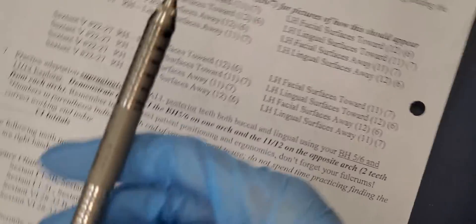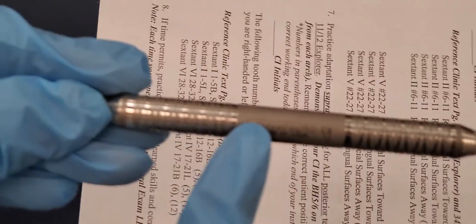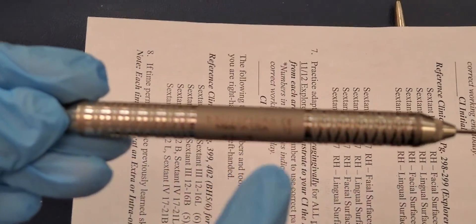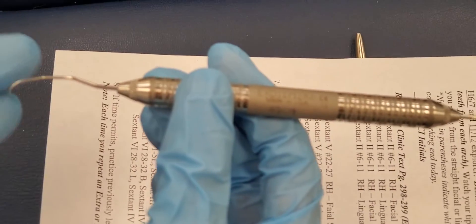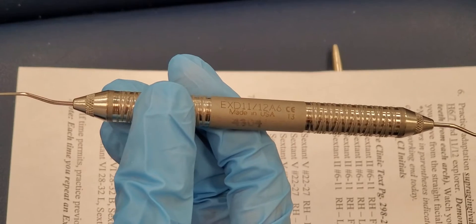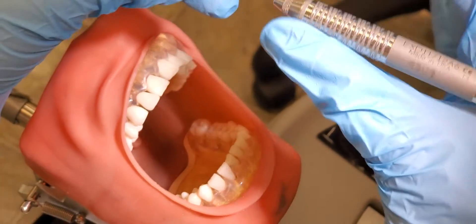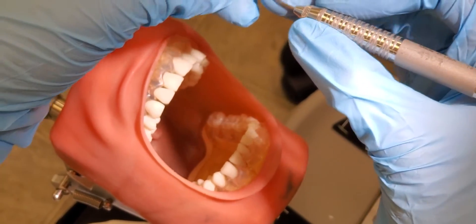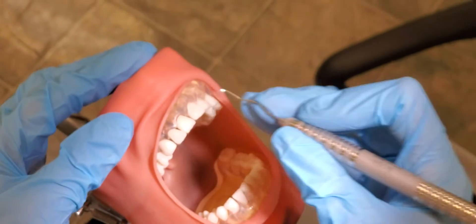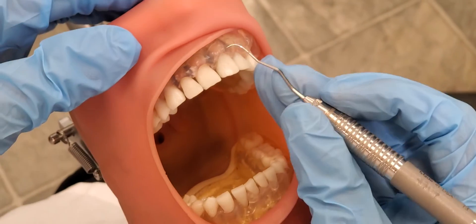Looking at my instrument, this says 11 and this says 12, so I know that I'll be using this end because it's end 11. We're going to first make sure I have a correct modified pen grasp with these fingers opposite each other, middle finger on the shank, and then my fulcrum, keeping that all together as I go onto the tooth.